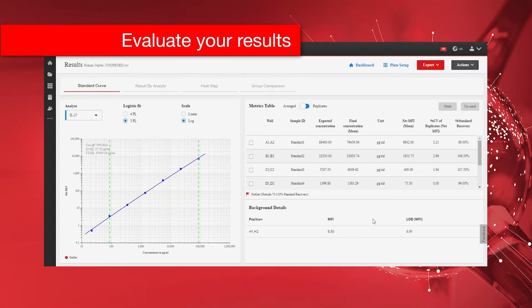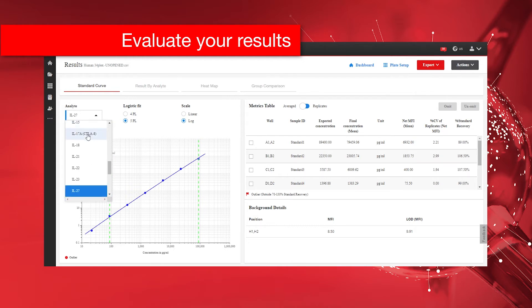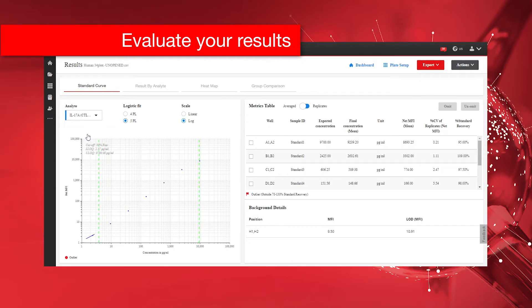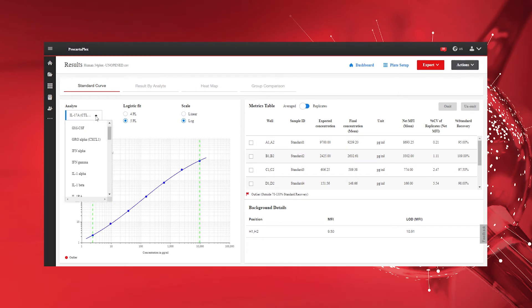The Standard Curve tab outlines the standard curve for each analyte that is part of your ProCartaPlex assay. Use the Analyte drop-down menu to switch between analytes.